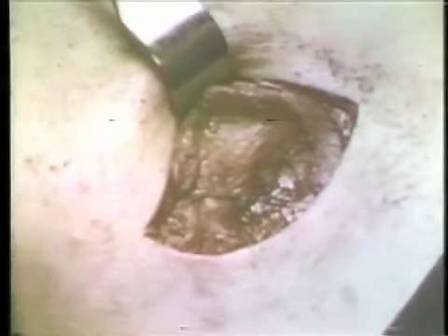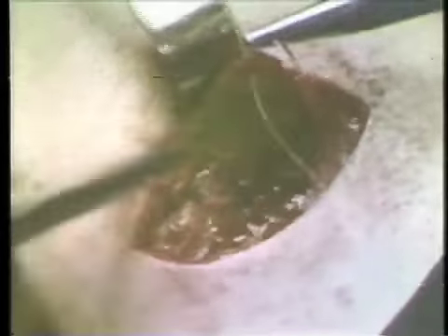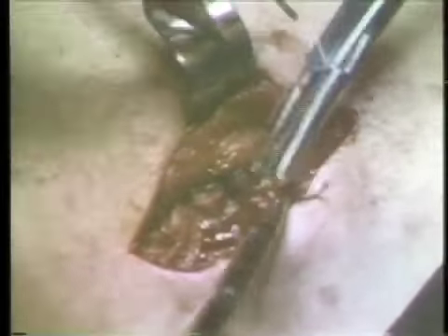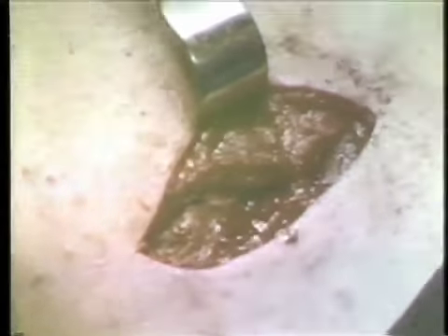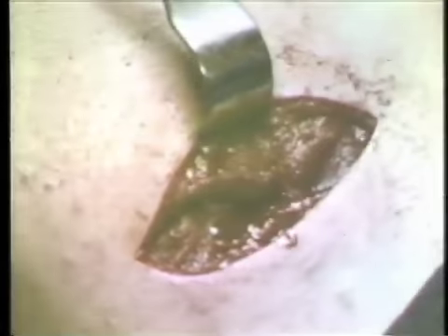The wound is closed in layers, and the platysma here is the next of the levels to close. These are absorbable buried sutures that you recognize, and the skin will be closed in another moment with standard methods.